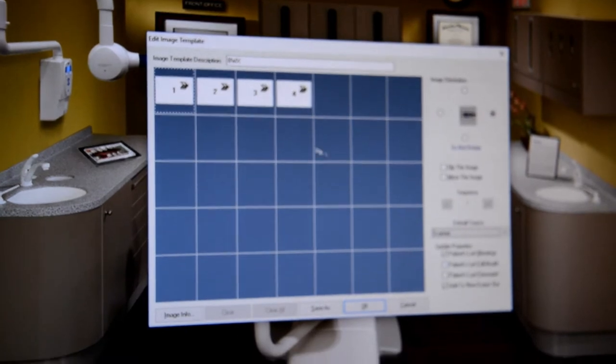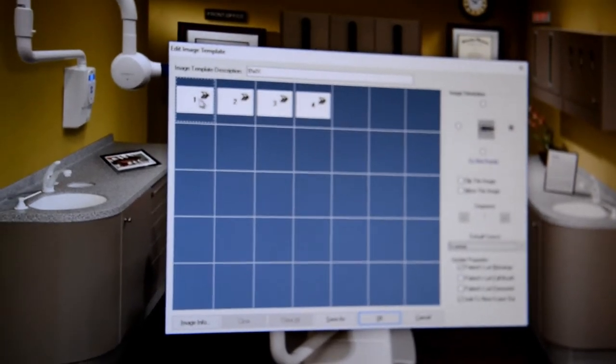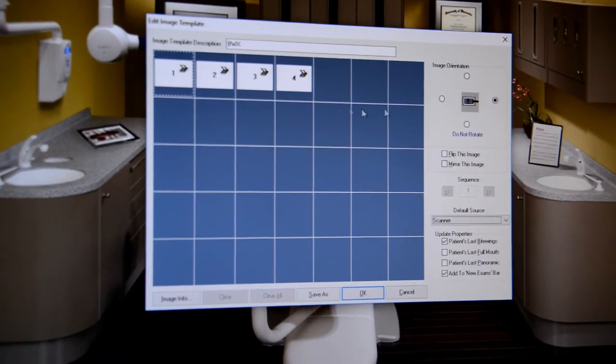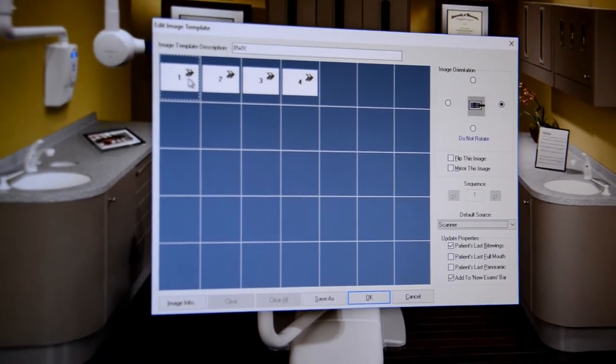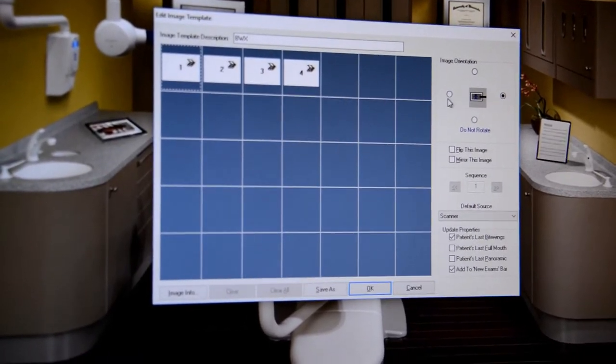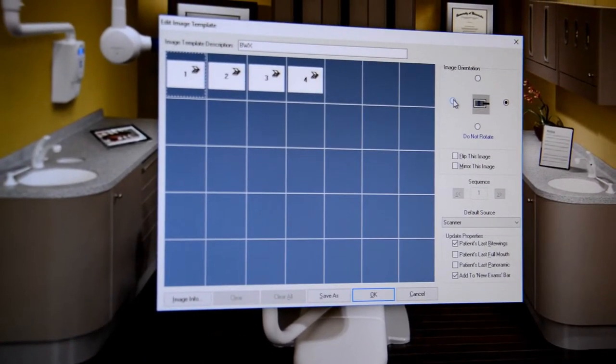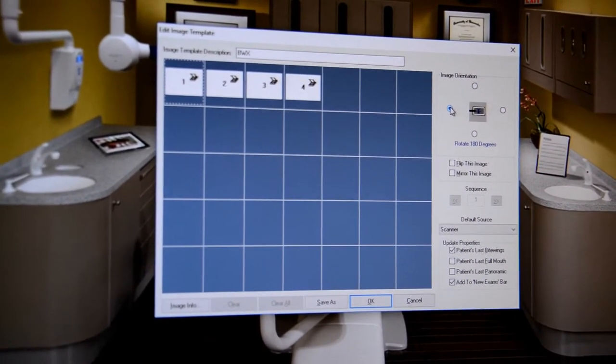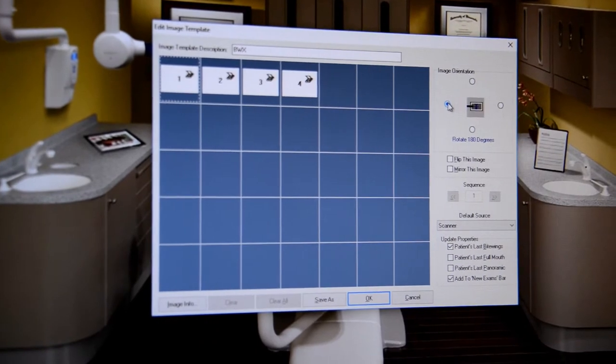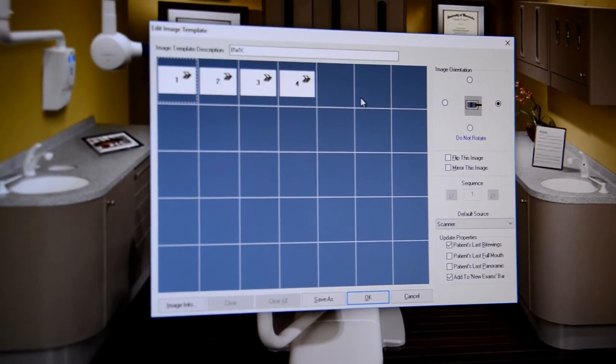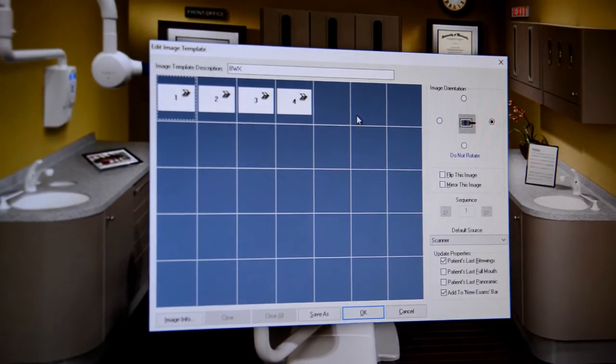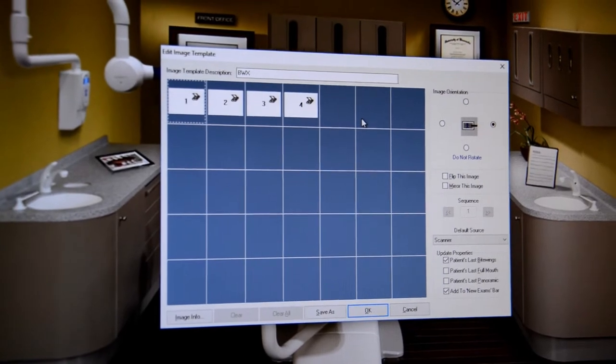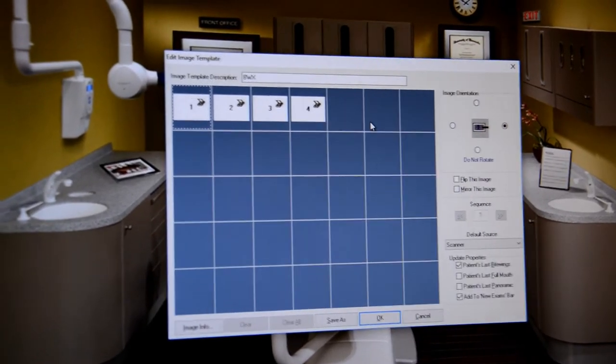We can also change if we wanted to flip. For example this image. If we wanted this to be flipped. We would rotate it by 180 degrees. If we wanted the image to naturally rotate 90 degrees. We could do the same thing.